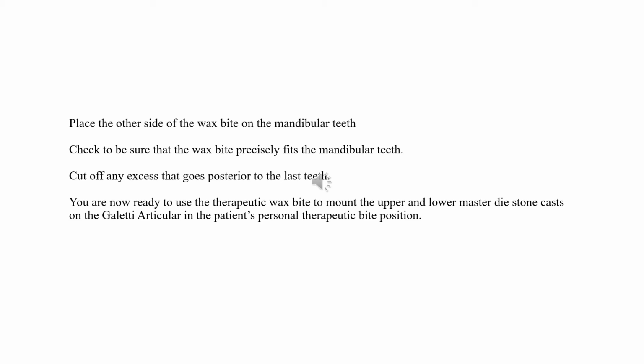And now, when that's been achieved, you know the upper cast fits beautifully into the wax. You know the lower fits beautifully into the wax. That wax now is going to hold the upper and lower teeth in the exact same position as the patient's mouth, at the exact same position of the therapeutic bite in the patient's mouth.